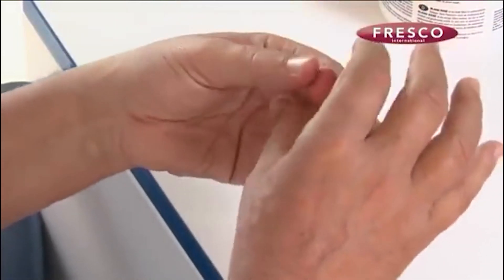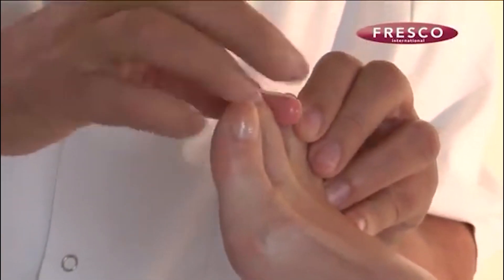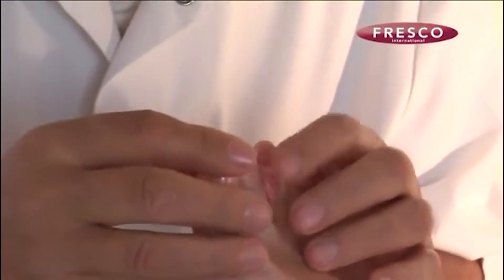When the silicon has reached the required consistency, it is applied to the foot and is delicately formed into the desired shape. In this way, we have produced an extremely comfortable orthosis for the patient, especially in geriatric cases.